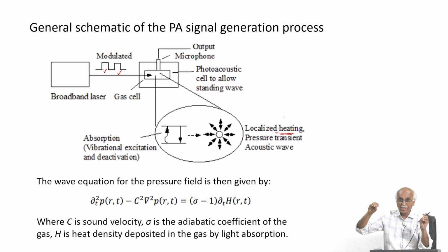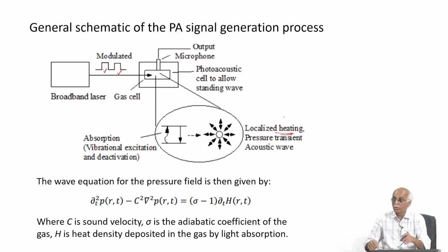If I send a second pulse, again heating, then cooling, heating, cooling. So, the molecules undergo heating and cooling based on the pulse input.